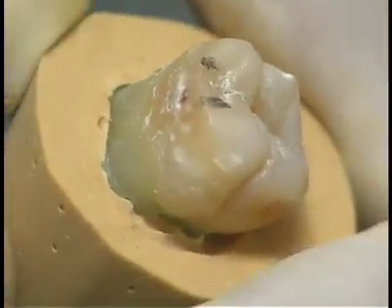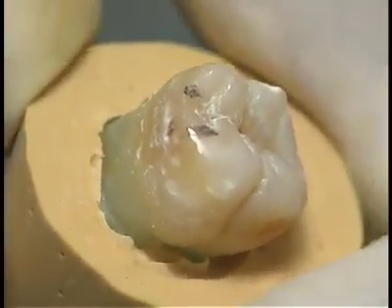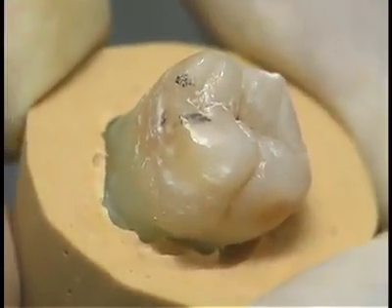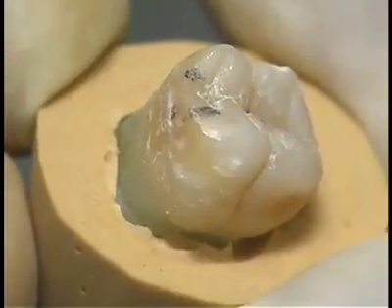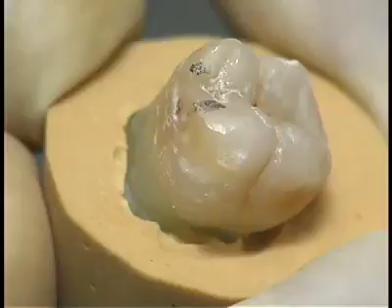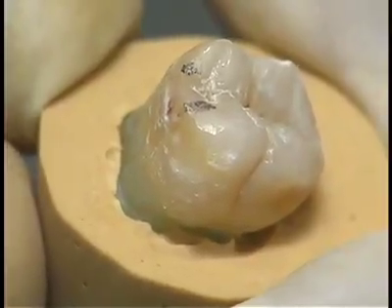A class 2 carious lesion develops apical to the contact area on the proximal surfaces of posterior teeth. The procedure for removal of the carious lesion is the same as that of a class 1. The first step is the development of the ideal cavity preparation.